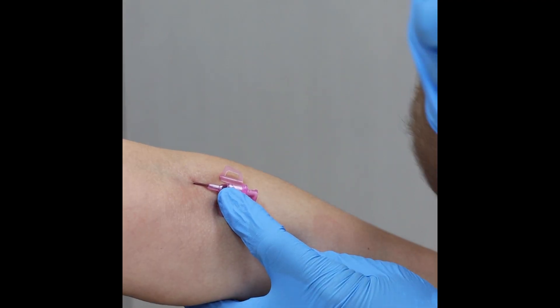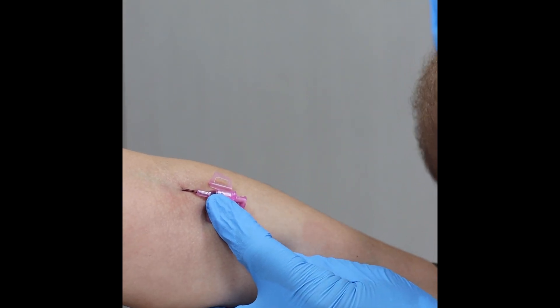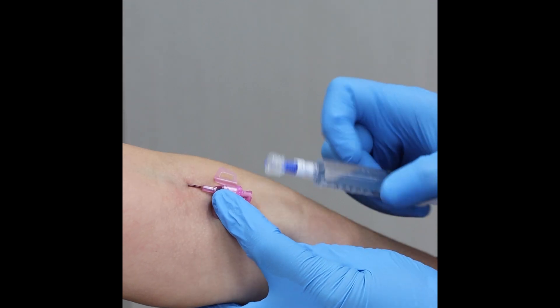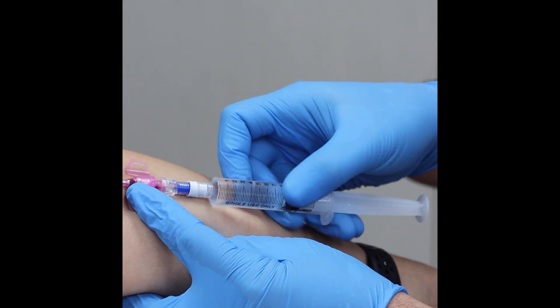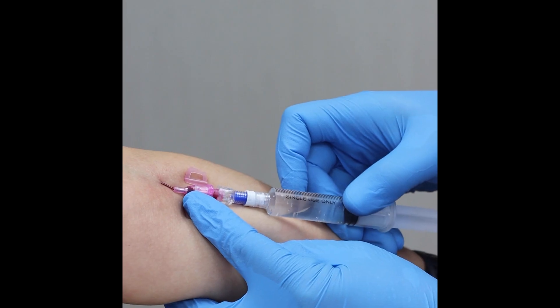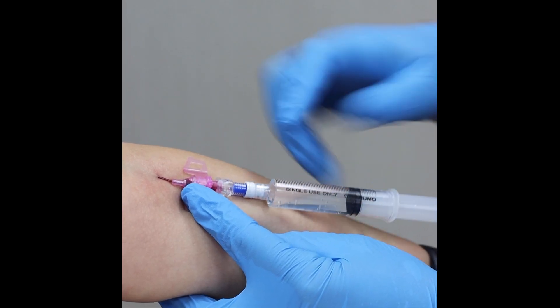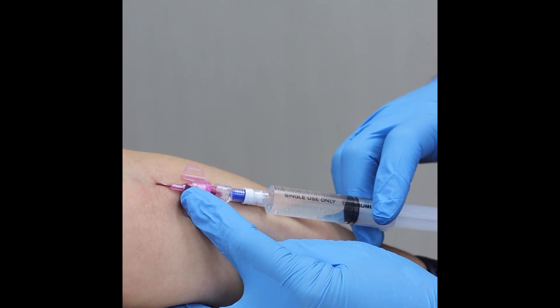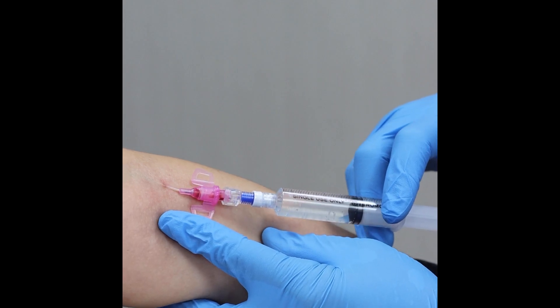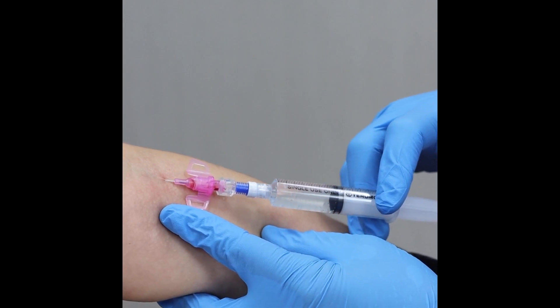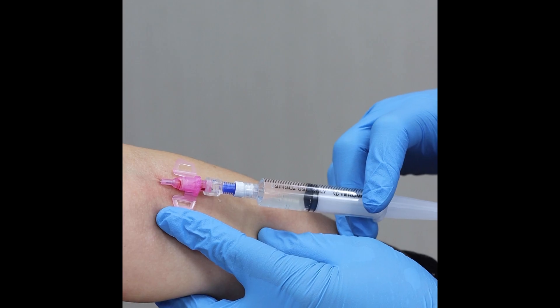What I've got here, I've got a pre-filled syringe of just some saline connected to my bung. So what I'm going to do, I'm going to twist the bung on and I'm going to be careful. I'm going to make sure that I'm securing the cannula with one finger and I'm twisting that on. And then what I'm going to do, I'm going to slowly push the fluid in and advance the catheter as we do it.